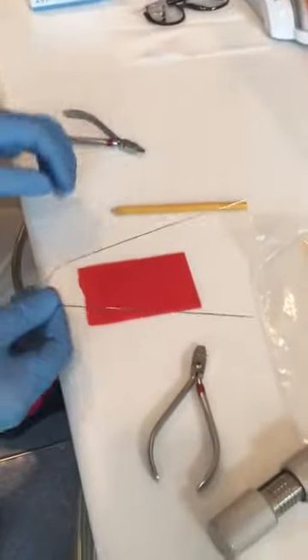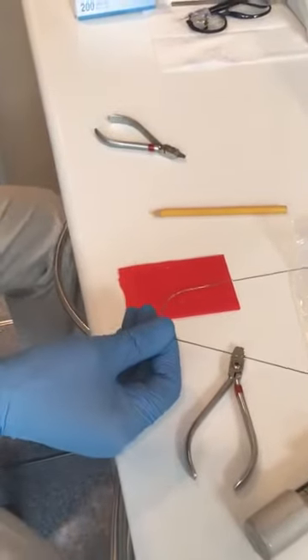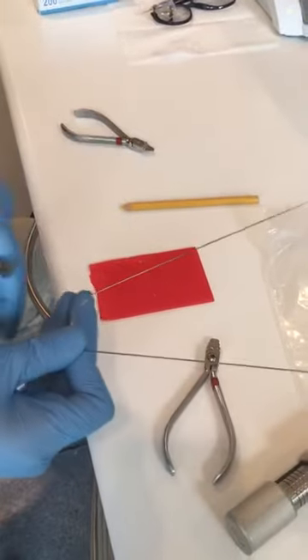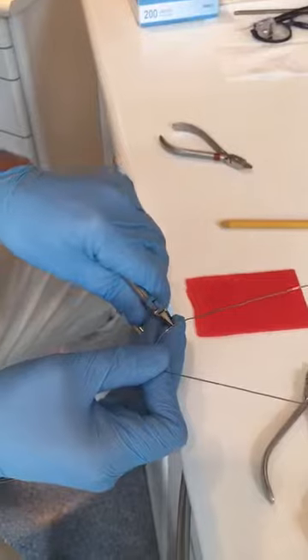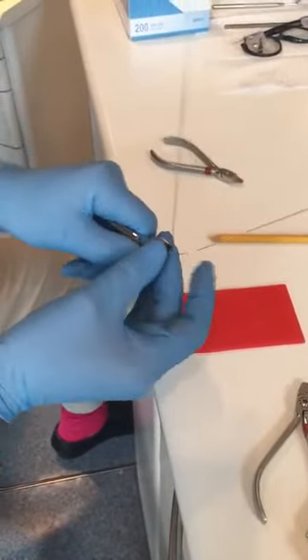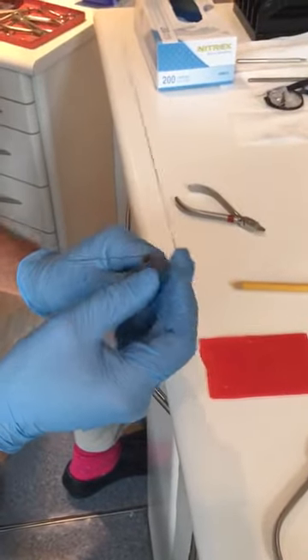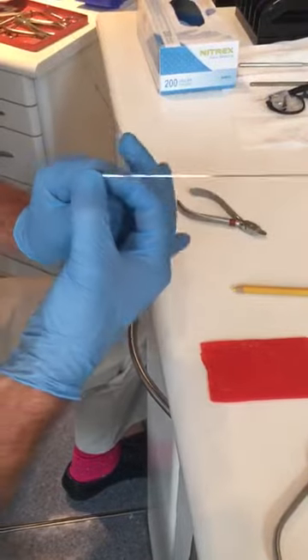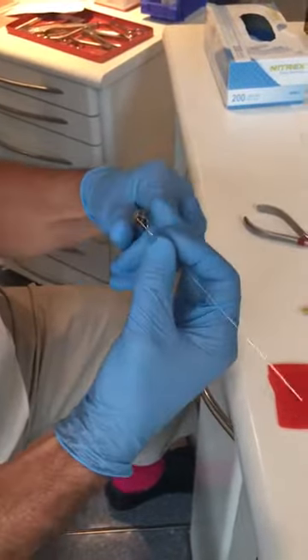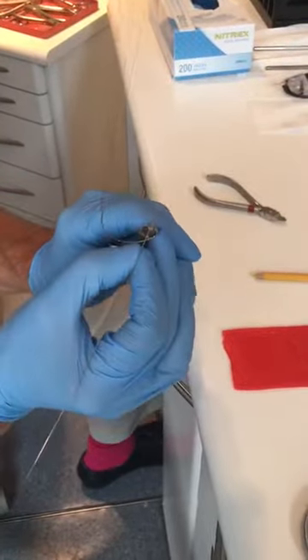Okay, so I know where the distal of the lateral incisor is now, so that's where I can start doing my bend. So I would pick a 139. I just do the first bend up there. So we've got a vertical bend there. Get straight in. And then we're doing the first triangle there.